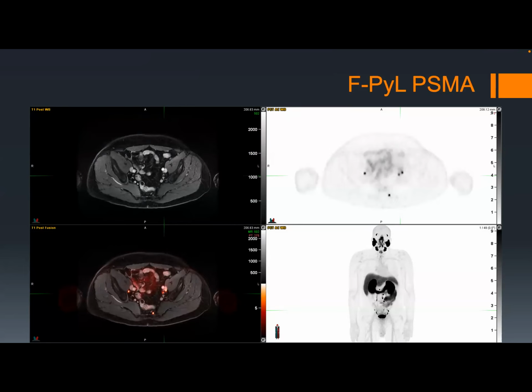And then on top of that, how much easier it is to interpret things when you have the MR to figure it out. So, this one, there are 3 Mets on this image, right? So here, here, and here, but we also have the ureter here. So it would be very easy, if you did not have the super, super high quality MR images to go with this, to say, oh, that's ureter because it's so small, right?